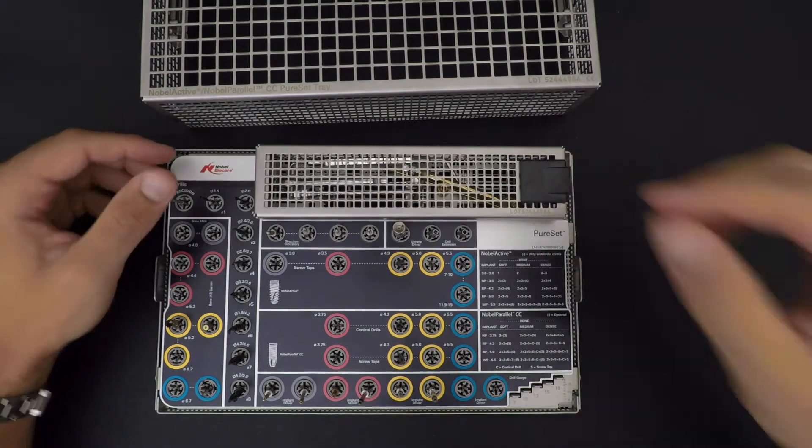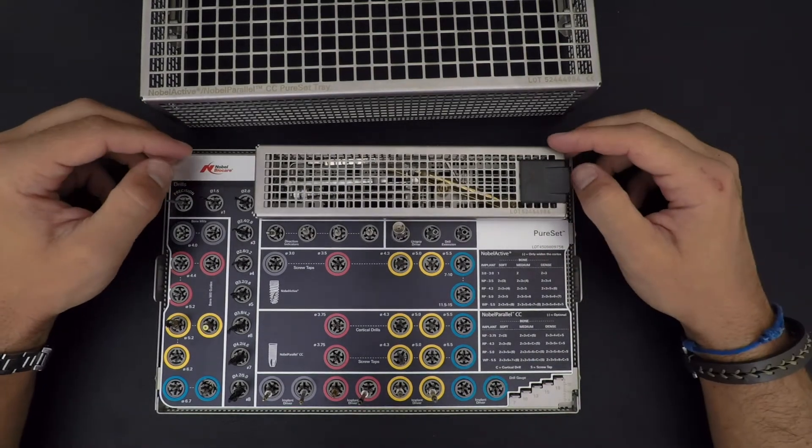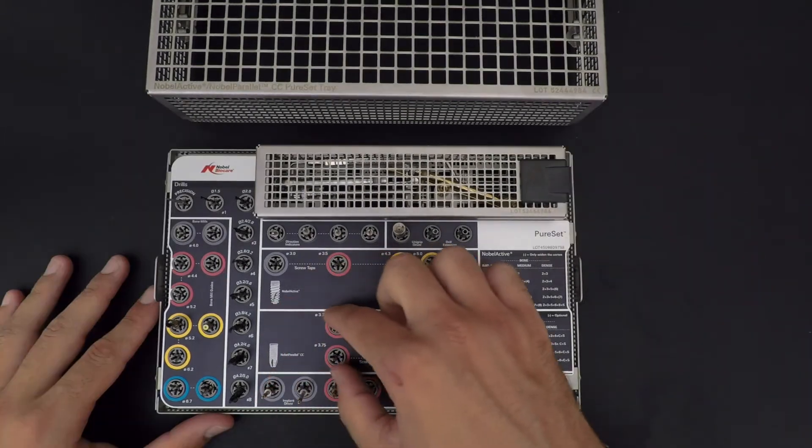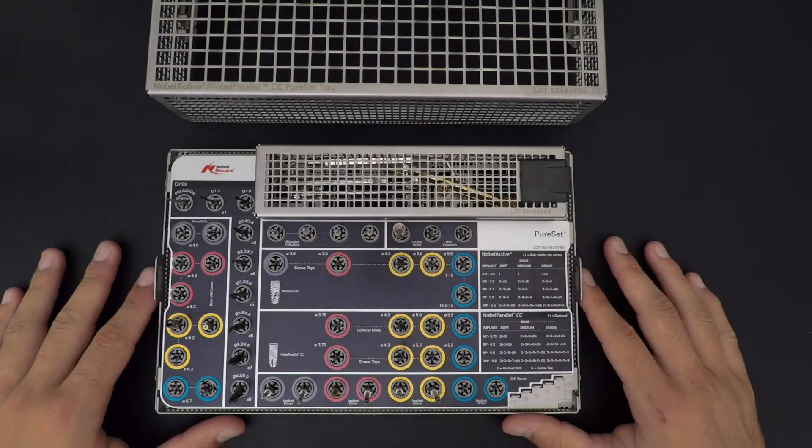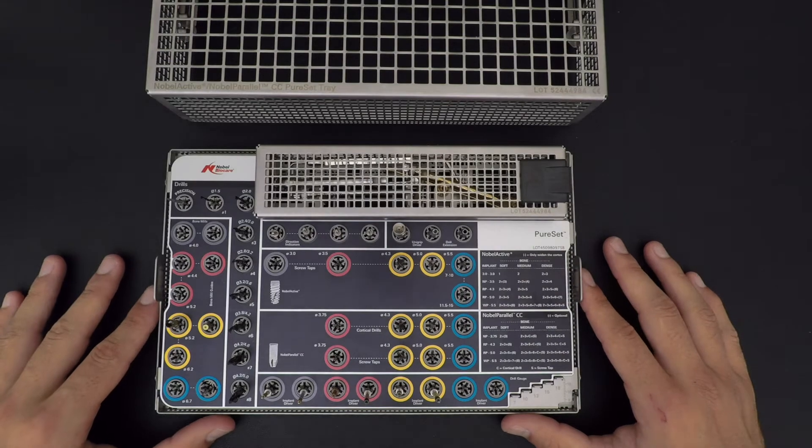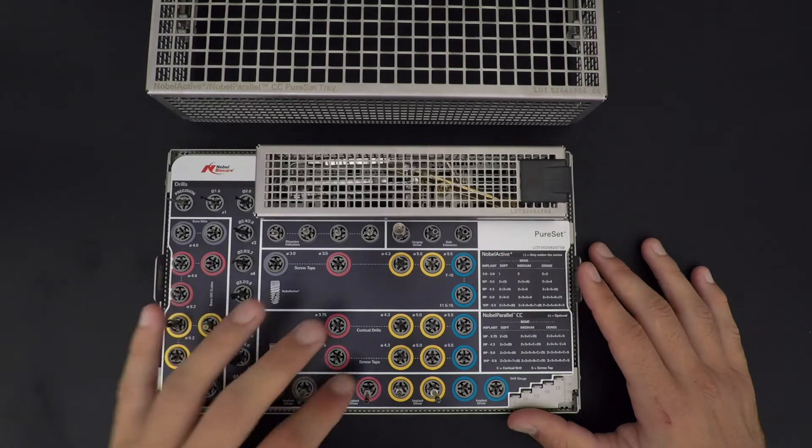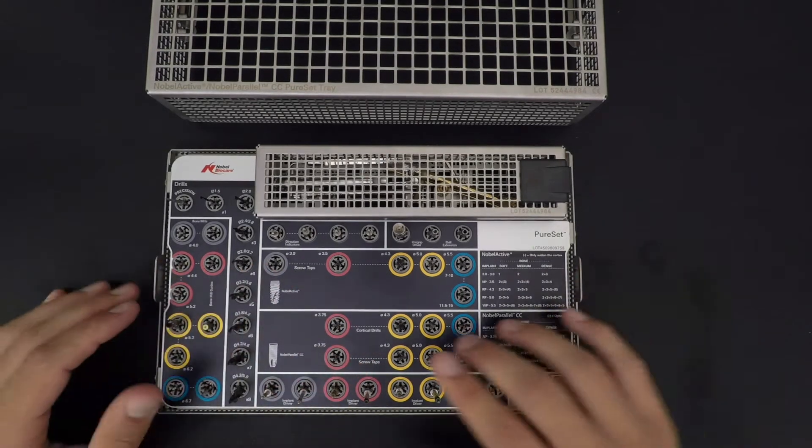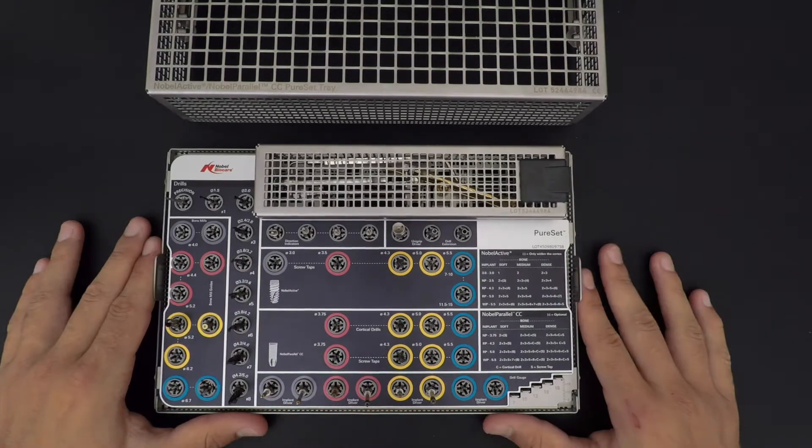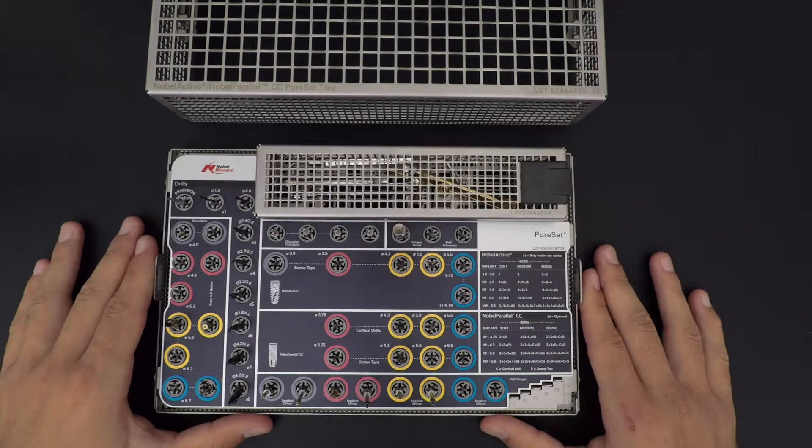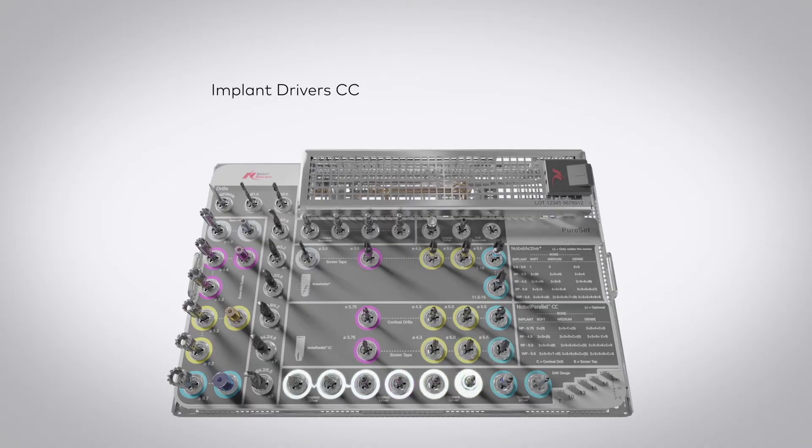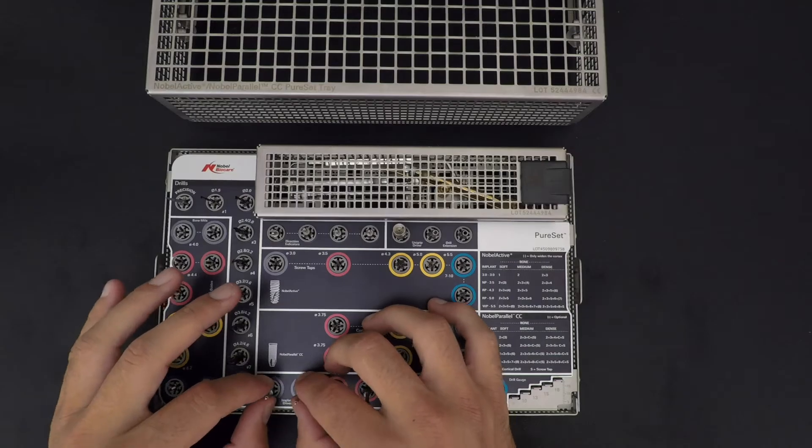Noble Parallel has two special drills: we got the cortical drill and the screw tap. At the bottom of the tray, we got our implant driver. For each implant platform, we got a short and a long driver.